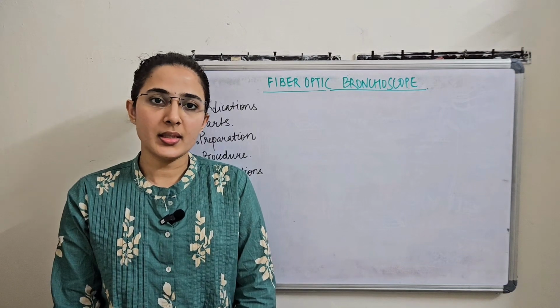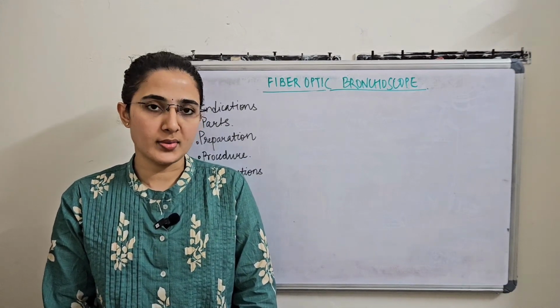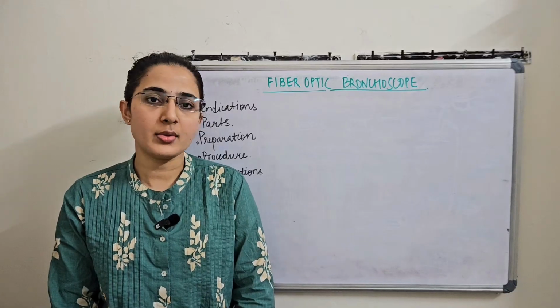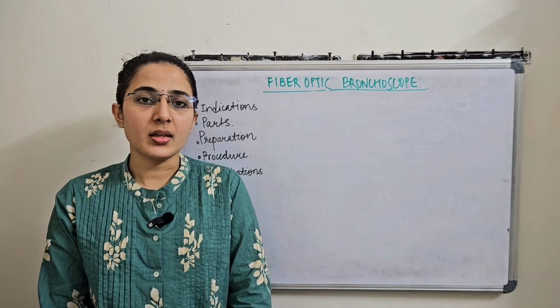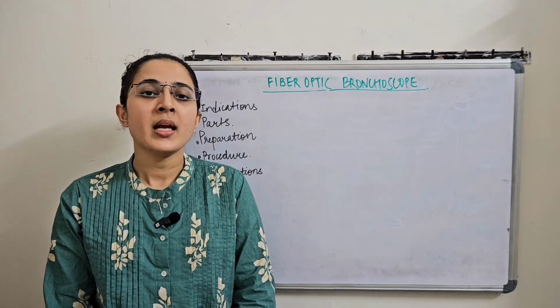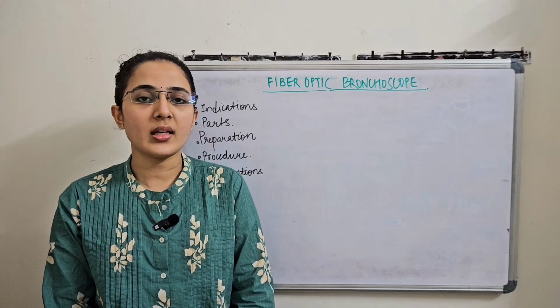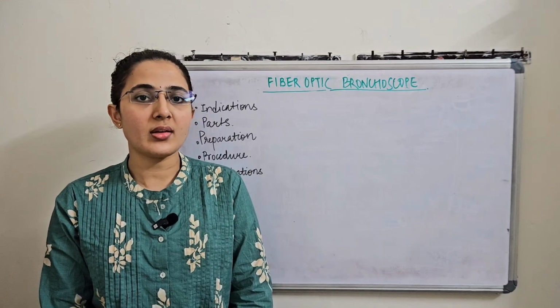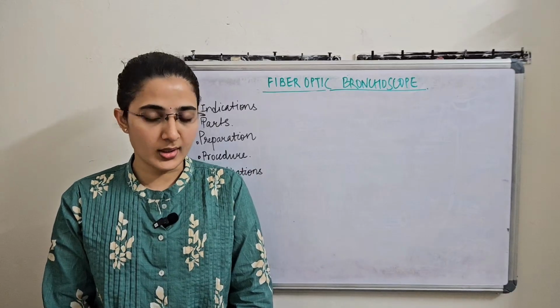So in this video, we'll be discussing what the indications of using a fiber optic bronchoscope are, and what the parts of the fiber optic bronchoscope are. We will see what preparation we require to do a fiber optic bronchoscopy, and in time we will see the views, and some tips and tricks on how we can do a better fiber optic bronchoscopy and intubation as well.